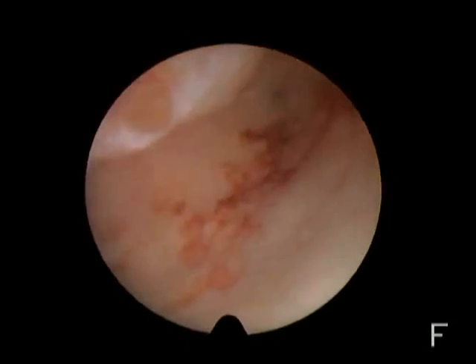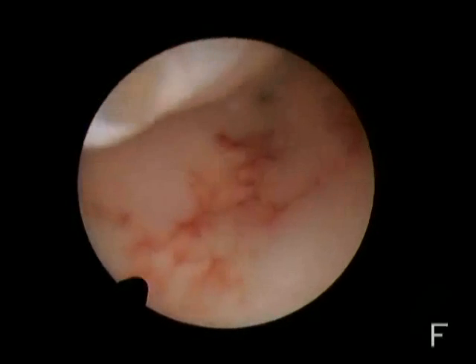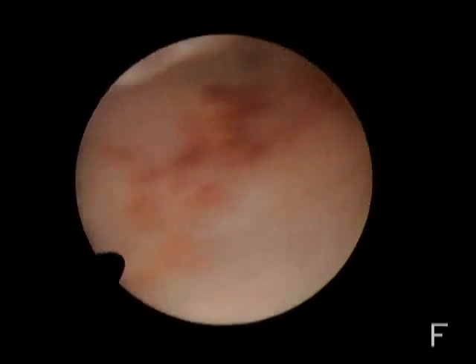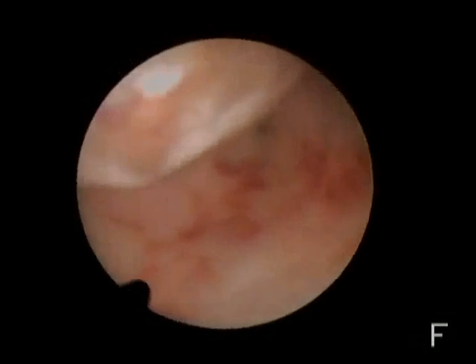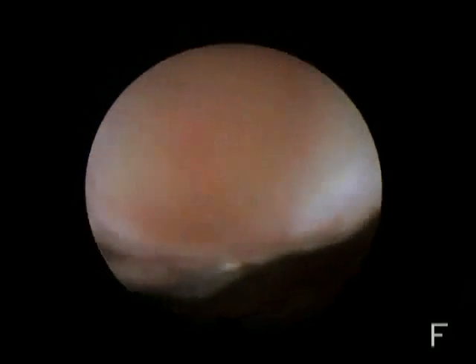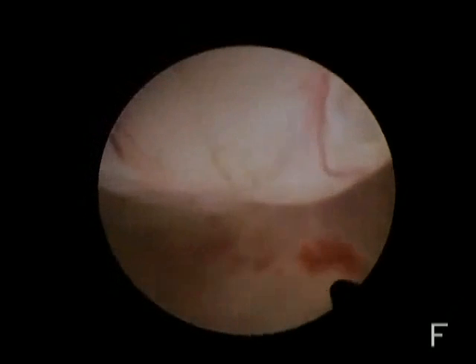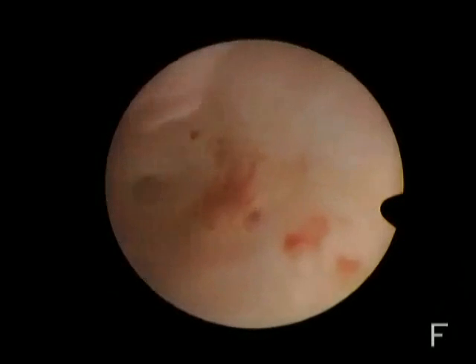So let's go. You see the ostium here at 1. We put the cable at 9 and we see the ostium. It's normal. And now we try to go and visualize the right ostium. So we are rotating the cable to 3, and here's the ostium. You see? Here it is.